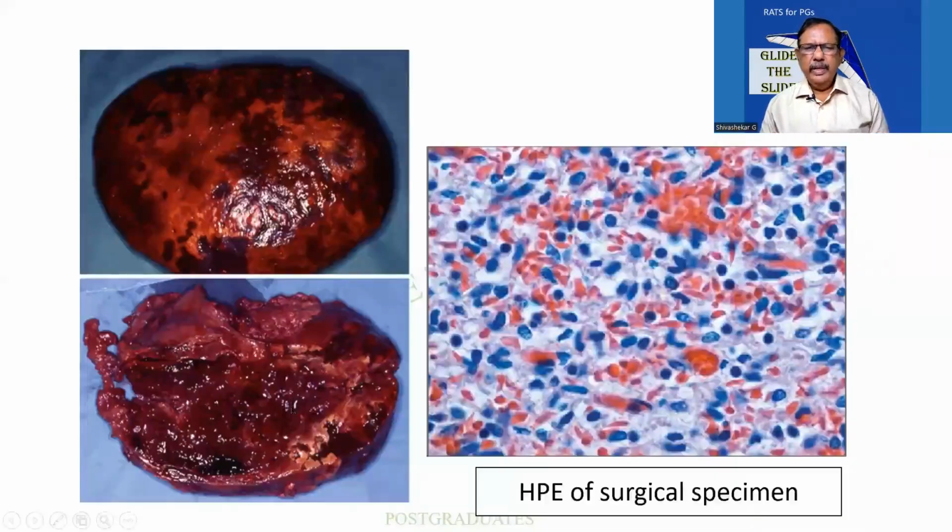So we had seen this. Obviously, a histology will be mandatory. And when a slide is taken, this is what we are seeing. I think you people can comment on the organ at least, leave alone the lesion. I am finding multiple small dark round cells and maybe some larger cells over here. There are also some spaces that I can see, which are being filled with blood. So my diagnosis or your diagnosis can be good.